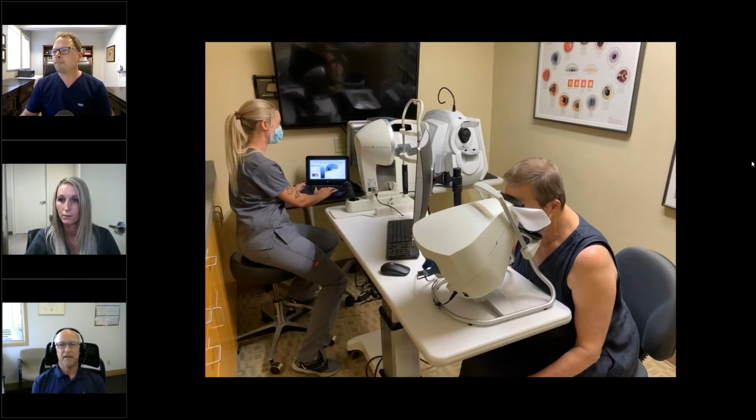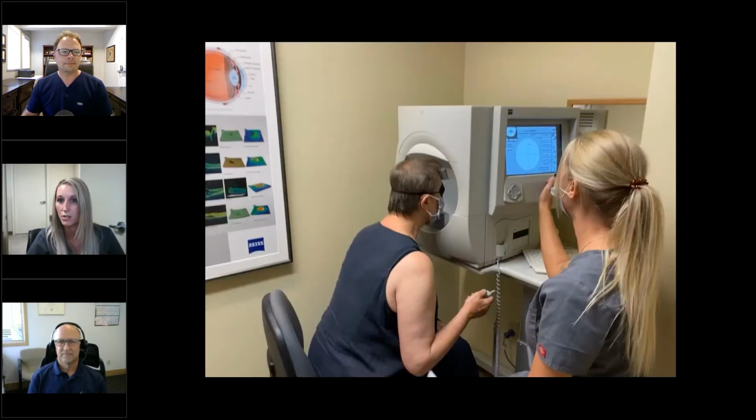Can you also comment on, I think early on, Brandy, you had done a comparison between patient comfort with the big perimeter versus the Smartfield. Can you comment on the patient's input? Yes, I did. I did some research comparing the two because I really wanted this device in our office. And so with the Humphrey, I don't know, Dr. Hale, if you can go back to the other image for me.